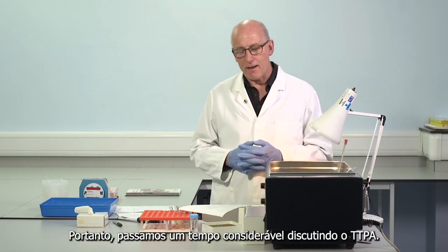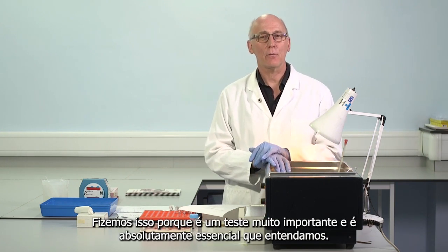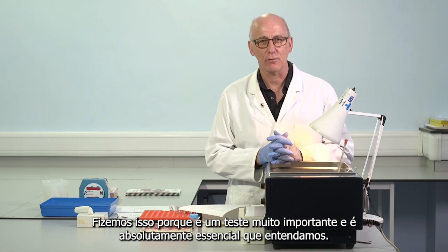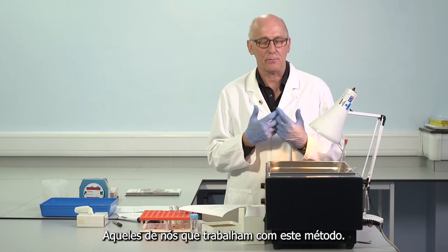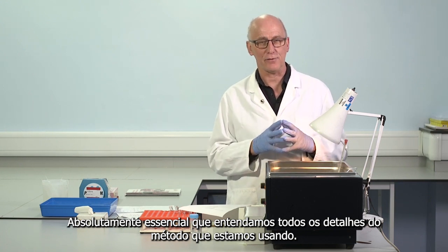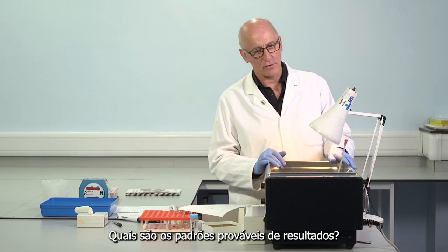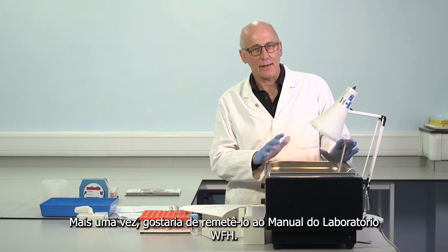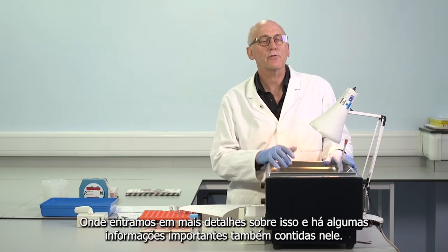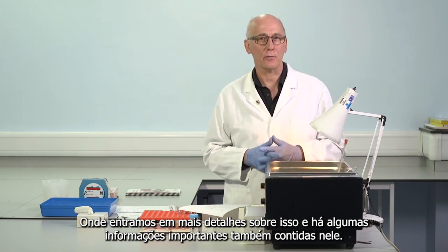So we've spent some considerable time discussing APTT. Thank you for your patience. I think we've done that because it's a really important test, and it's absolutely essential that we understand, those of us working with this method, it's absolutely essential that we understand all the detail of the method that we're using. What's its limitations? What will it tell us? What are the likely pattern of results? How to interpret those? And again, I would refer you back to the WFH laboratory manual, where we go into some more detail about this, and there's some important information also contained within this.